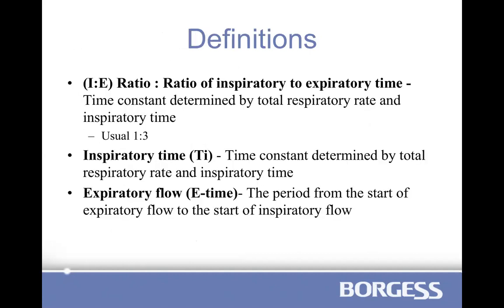So some other concepts we will briefly talk about. These are also things that can be controlled by the ventilator, and it's the ratio of the time spent in inspiration to expiration. The vent is only active during inspiration. The only thing that we can control on a ventilator is during the inspiratory time of the breath. So I can determine how much oxygen is being flowed in. I can determine the milliliters of volume that is delivered, the pressure at which that volume is delivered.